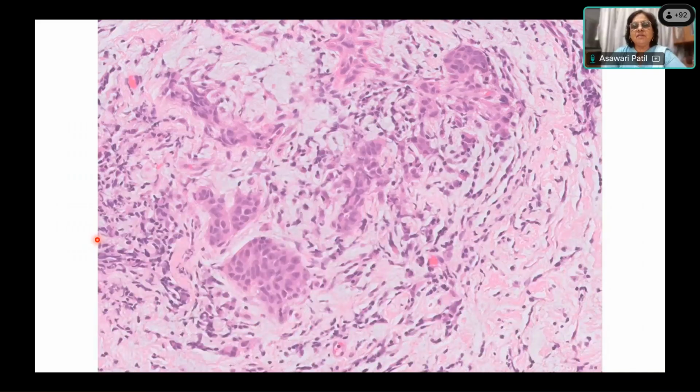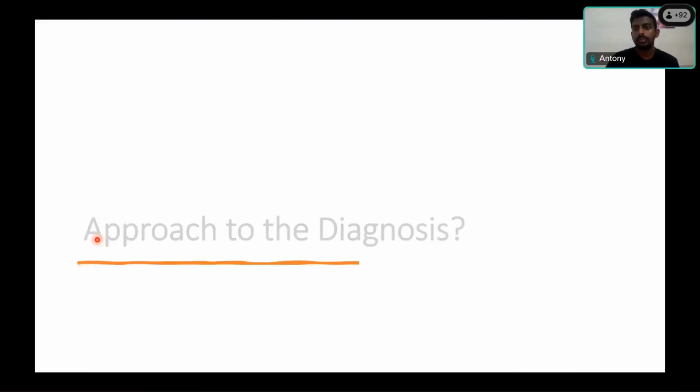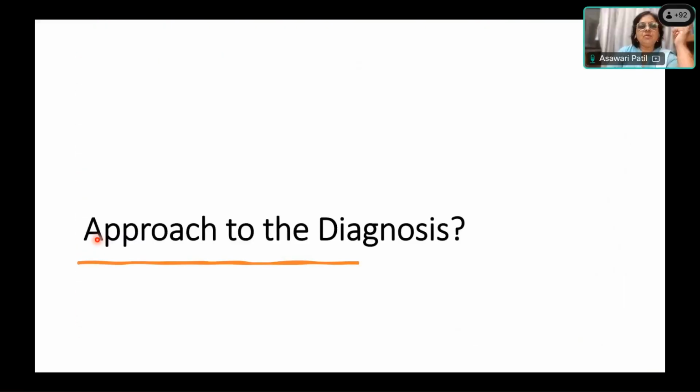So this is our invasive carcinoma. What is your diagnosis? DCIS with foci of invasion. Foci of invasion, or what we discussed just now? Microinvasion. Microinvasive.